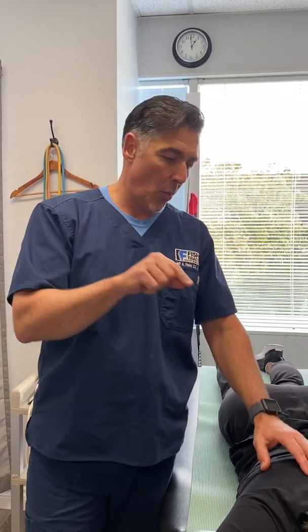But the key with the ultrasound and muscle stim at the same time is that when you're activating the area of injury or the area of complaint, that patient can tell you, oh yeah, that's it. And that's what you want them to say, because then you can concentrate the vast majority of the treatment time on that injury spot or that dysfunctional spot. Because with ultrasound, you want to try and get the maximum amount of time on that spot.